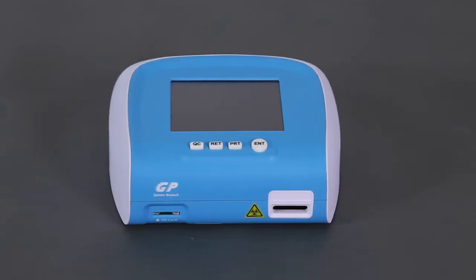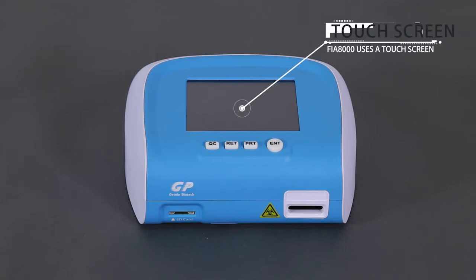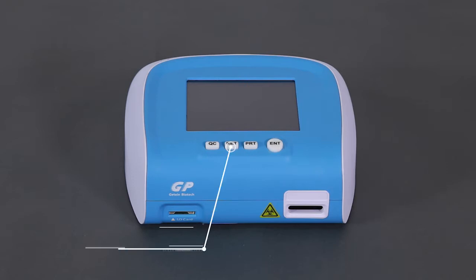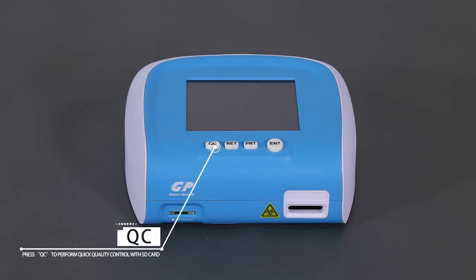The features of FIA 8000: FIA 8000 uses a touchscreen. Press ENT to start a test and to select options. Press RET to return to the previous interface. Press PRT to test the printing function or print a testing outcome manually. Press QC to perform quick quality control with the SD card.